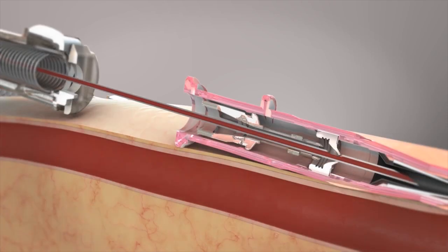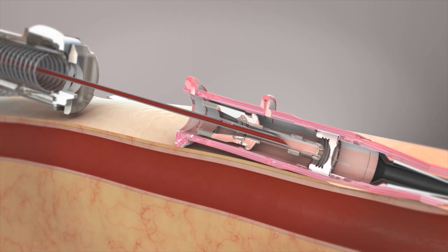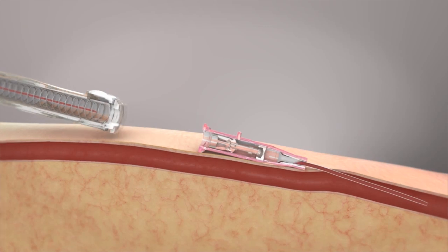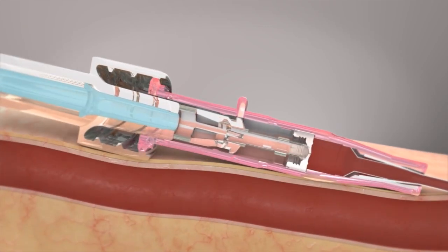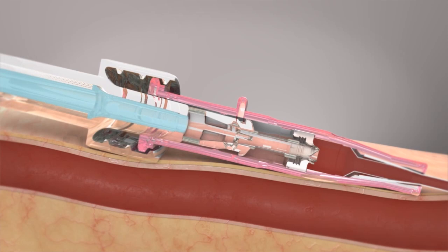As the needle retracts, the blood control septum closes to stop blood from flowing out of the catheter hub. When a luer connection is made, the septum is permanently opened, allowing flow into and out of the catheter.